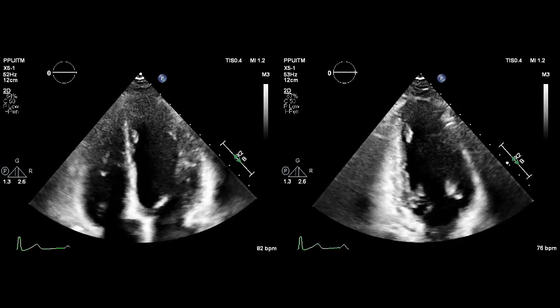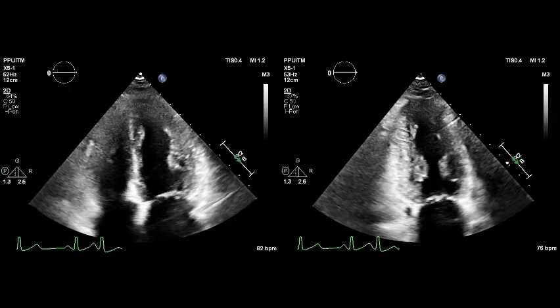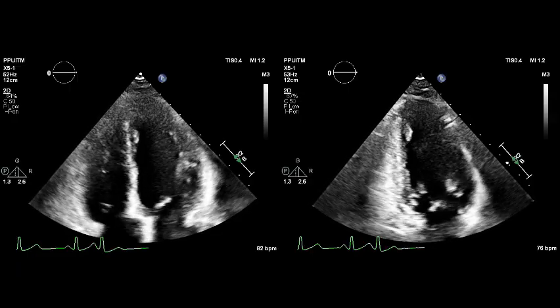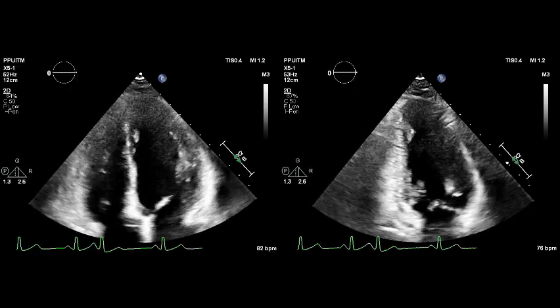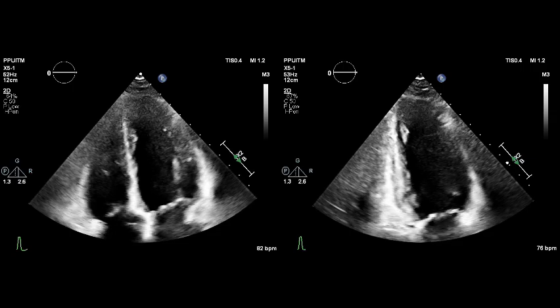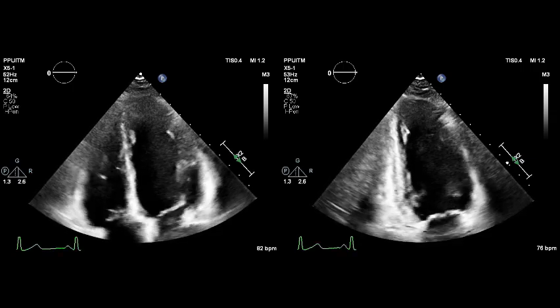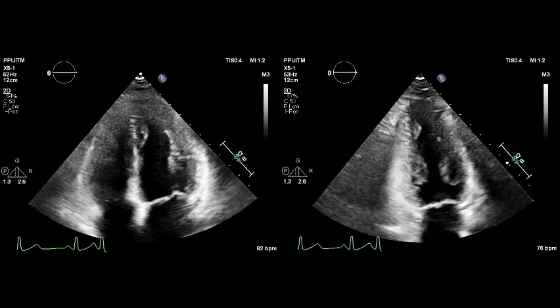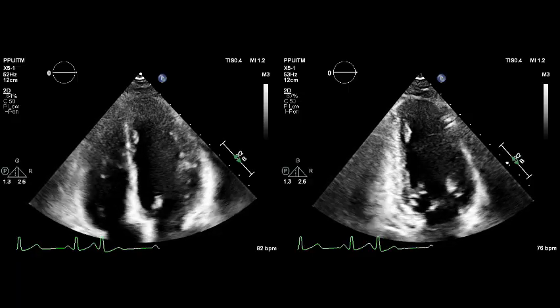She has a brother who's 21 years old who died from hypertrophic cardiomyopathy. So yes, we have to do an echo just to make sure. Do you think it's hypertrophic? Okay, so these are papillary muscle, so it's just a bit of thickening of the papillary muscle, but it's not actually hypertrophic. The LV is actually quite healthy, EF is 55% as well. So maybe she doesn't have the condition like her brother, right?